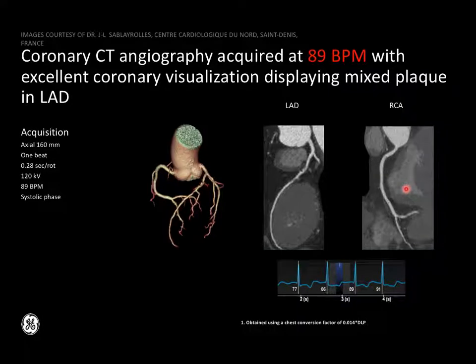Okay, so statins are the way to go if you detect that signal on a CT scan. And really, the CT is the only way to detect that calcium signal. There's no other good imaging technique. You do it without contrast. You don't have to inject contrast, and so the patient lies in the scanner. It takes a fifth of a second to take the picture, and it costs about $100.